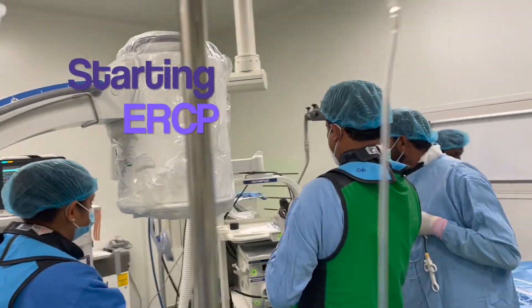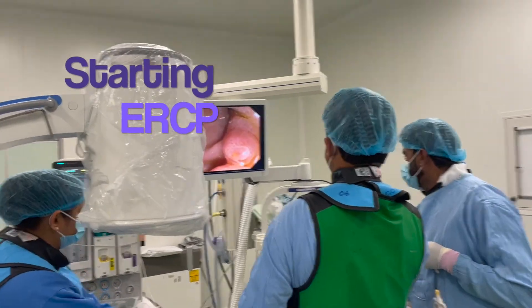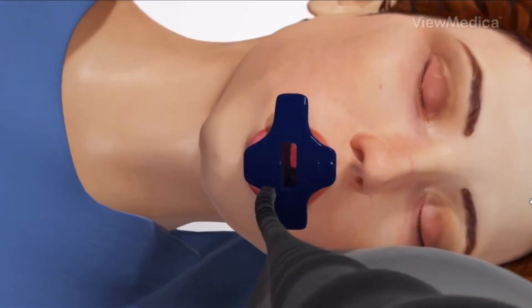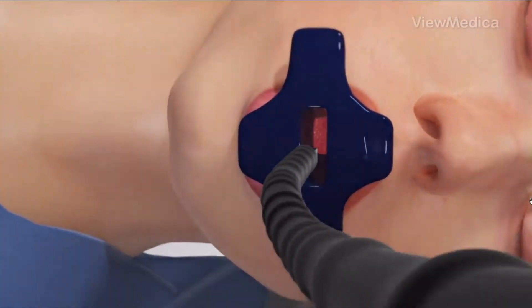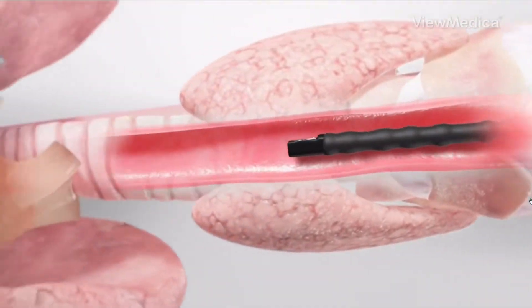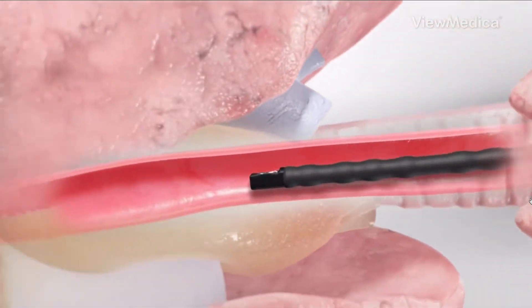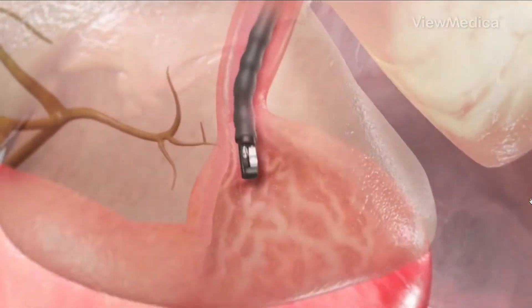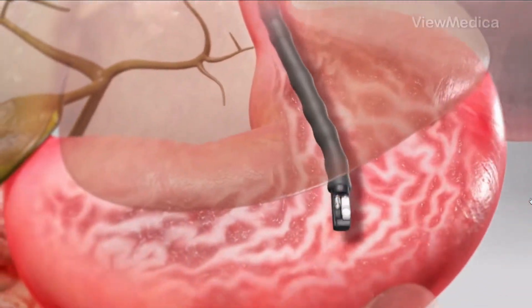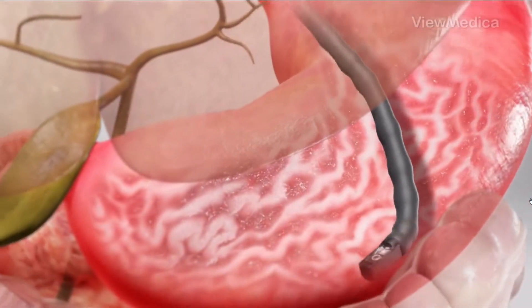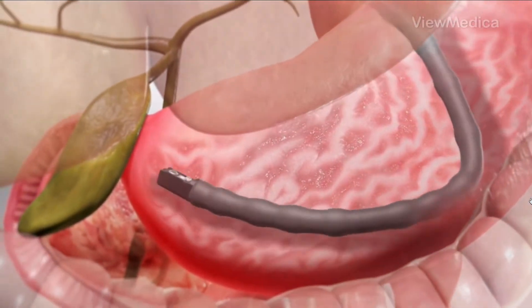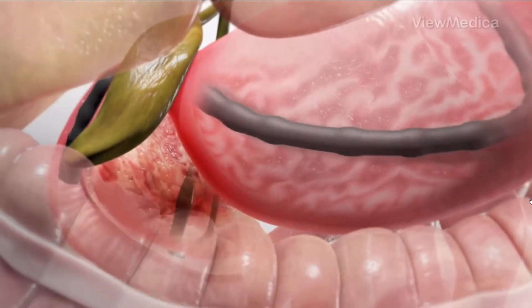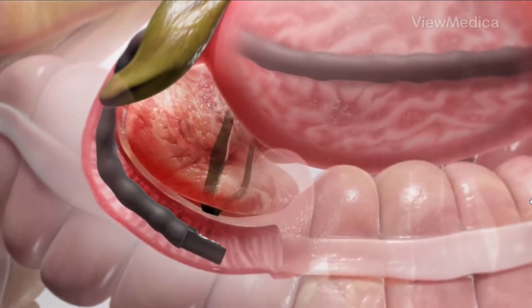What is ERCP? Endoscopic retrograde cholangiopancreatography is a procedure that combines upper gastrointestinal endoscopy and x-rays to treat problems of the bile and pancreatic ducts. The doctor will carefully feed the endoscope down your esophagus, through your stomach, and into your duodenum.